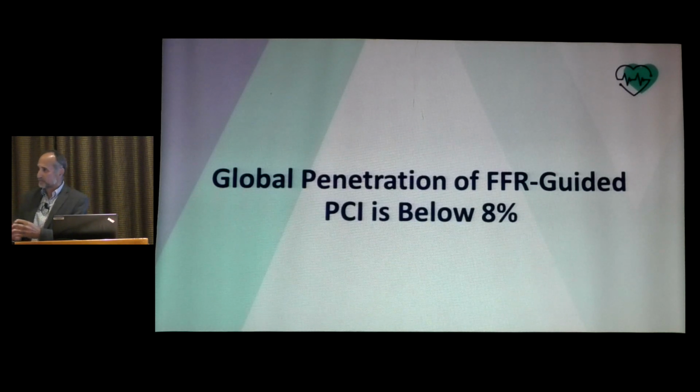Why? Because it has problems. First of all, as Mahmoud said, it adds to the expenses. There's a price that you have to pay, the price of the wire, the price of using the machine. And administering adenosine or any vasodilator is sometimes very uncomfortable to patients. It produces chest pains, it produces dyspnea, it leads to sometimes a drop in the blood pressure. Sometimes patients feel that they're dying, and also some patients get bronchospasm, some patients even get arrhythmias, sometimes even ventricular arrhythmias, which would require a cardioversion. So there are problems associated with administering adenosine in these patients, as well as the expenses, which make FFR not really a very popular test.